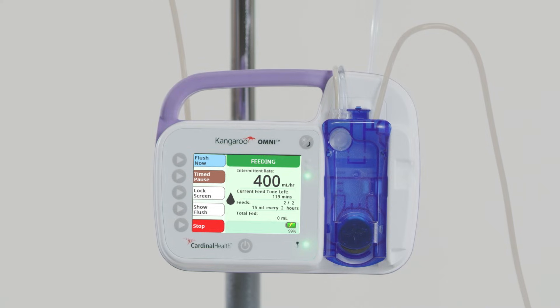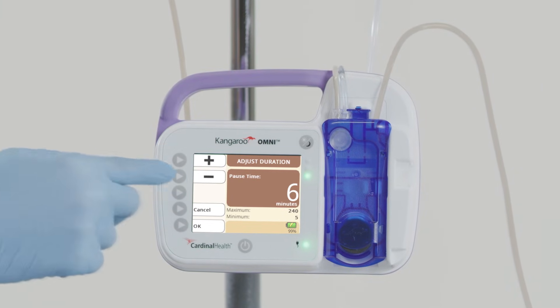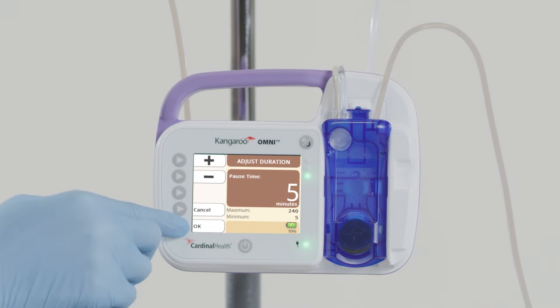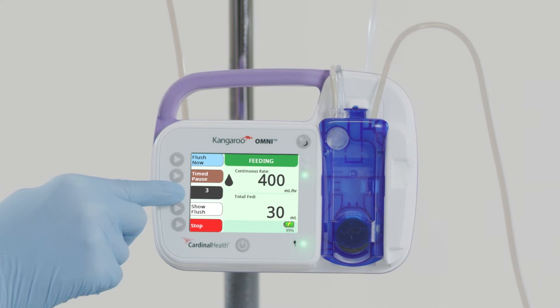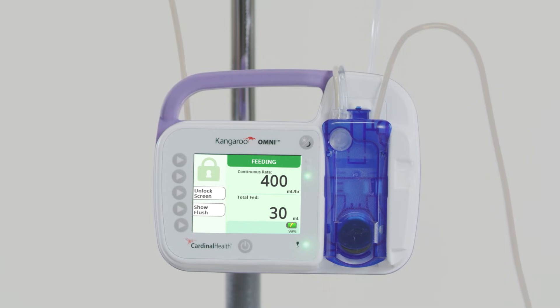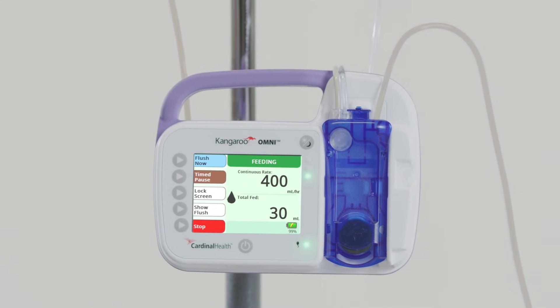To pause feeding, use the Timed Pause feature to pause the pump between 5 and 240 minutes. Press the Timed Pause button — the default pause is 5 minutes. To increase the duration, press Adjust Duration and use the plus and minus buttons to select the new duration, then press OK to confirm. The pump will automatically resume feeding once the timed pause is complete. To end timed pause early, press Resume to immediately resume feeding. You may also lock the input screen to prevent accidental button presses during portable use. Press and hold the Lock Screen button for 5 seconds; a lock symbol will appear. To unlock, press and hold the Unlock Screen button for 5 seconds.